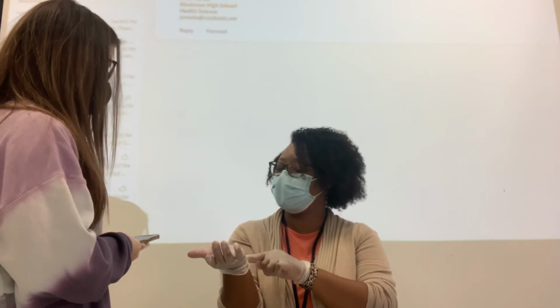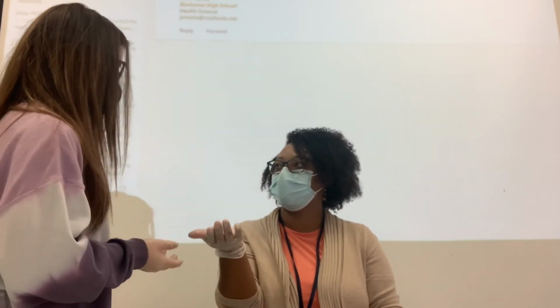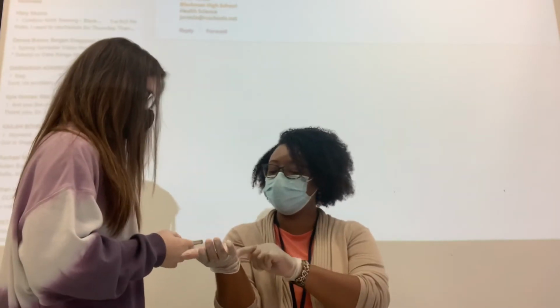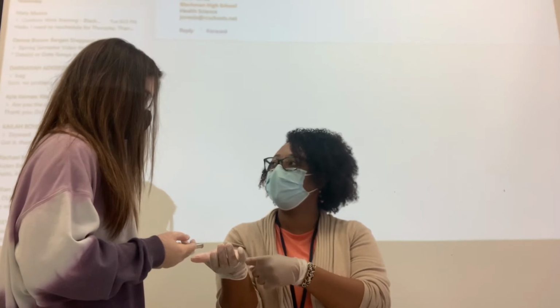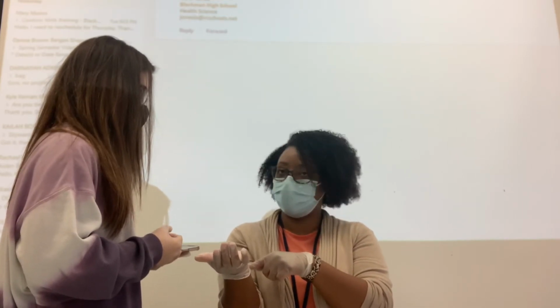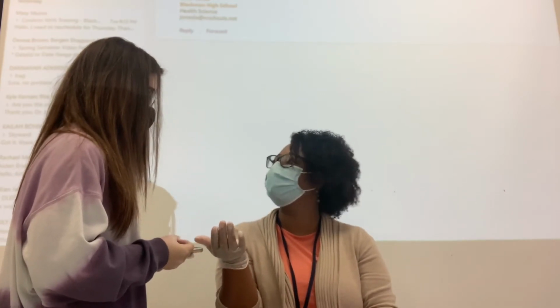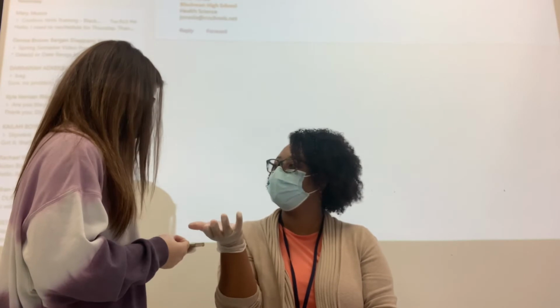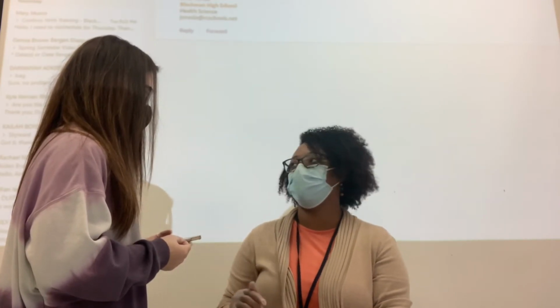And you're gonna ask me my birthday. You check the wristband, you ask me my name, I gave you my name. And then you check my band to make sure, see what my birthday is, and ask me my birthday. All right, so then I tell you, and you know you have your right patient. Okay, so now you're gonna do my pulse.